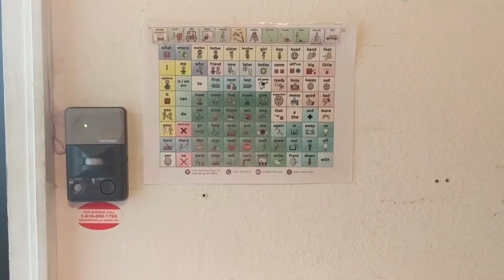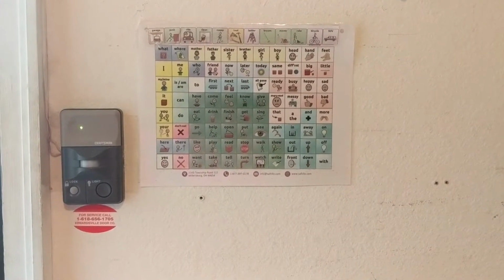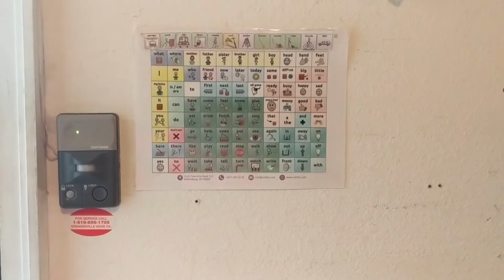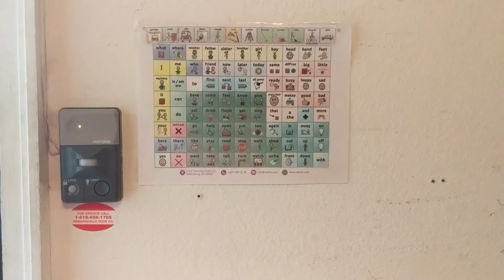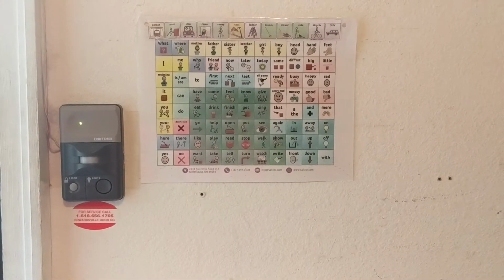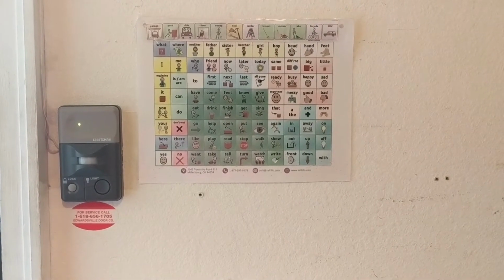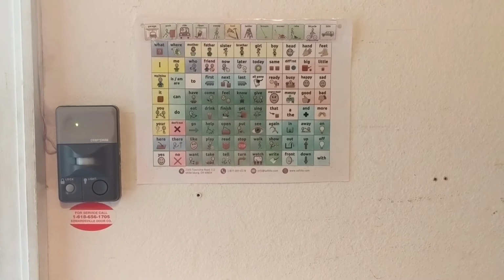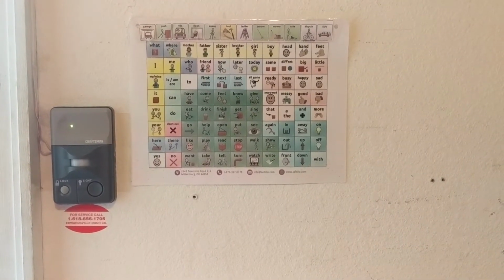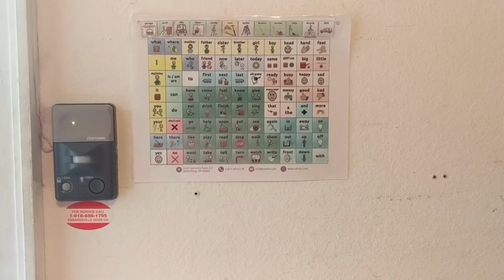So the vocabulary that I have here is the same vocabulary in the rest of the videos. It's the Tell Me 88 vocabulary from Saltillo. It's free to download from their website, and I have links down below. There are also videos on the YouTube channel Basque AAC that I co-collaborate on, and we show you how to go and get free communication boards from 4 of the top vendors for different AAC systems as well.